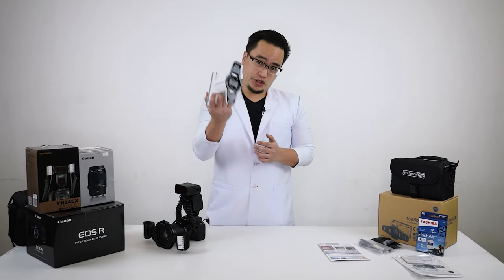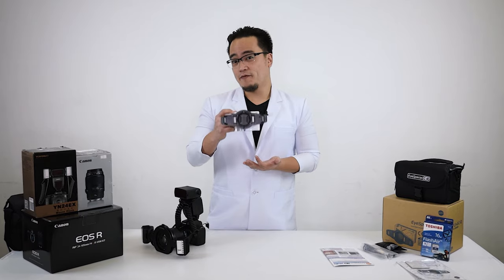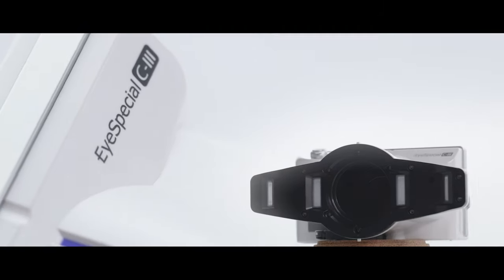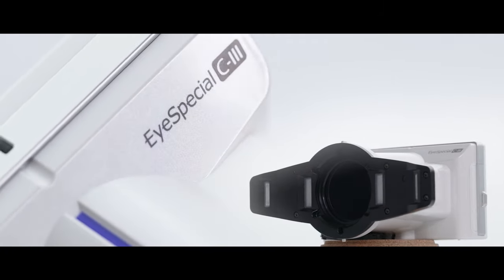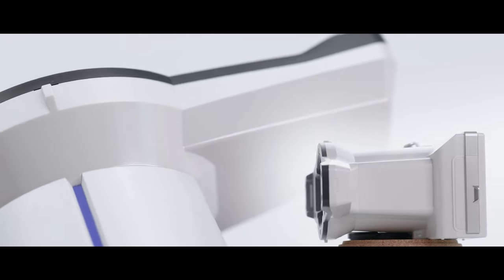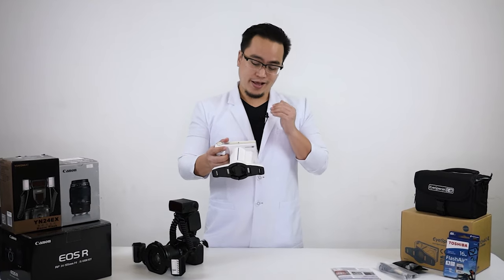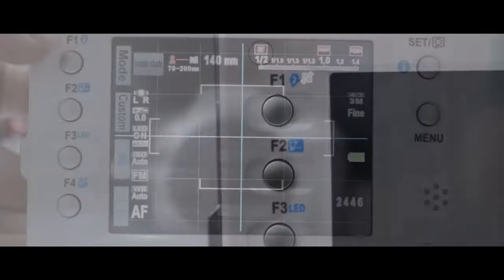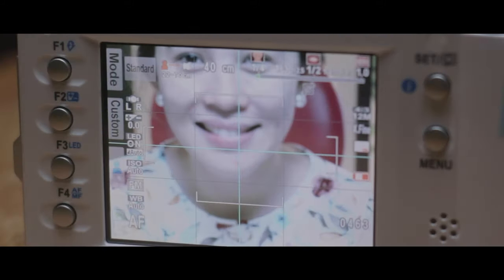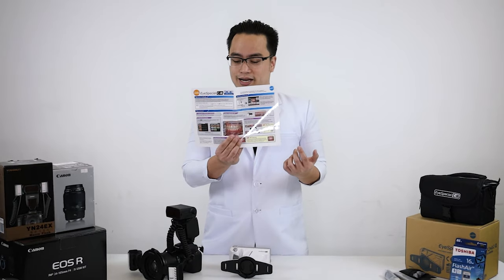Right off the bat, just holding it, I can feel that this was specifically designed for dental photography. It's very sleek, very clean. There are no unnecessary grooves and niches that dirt or saliva could get into, so wiping it down is quite easy. Next, there are presets — predetermined functions for specific use such as intraoral, smile, and even isolate shade — which are all referenced in the quick start guide.